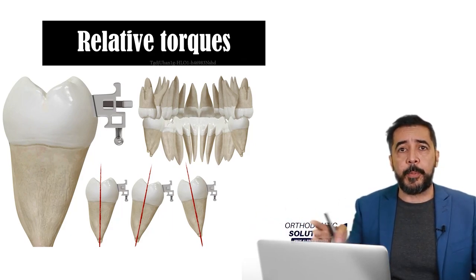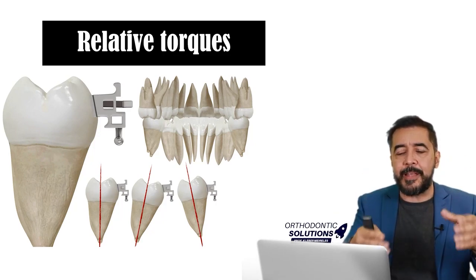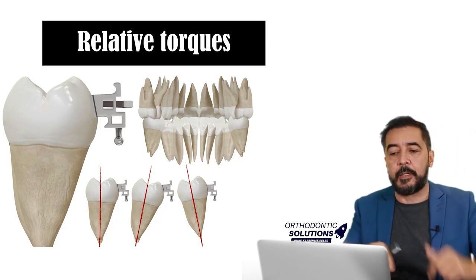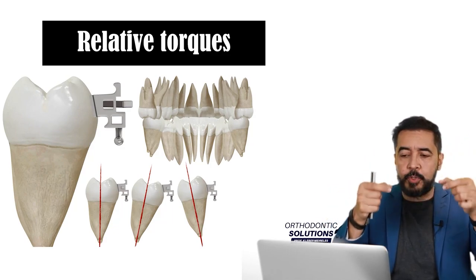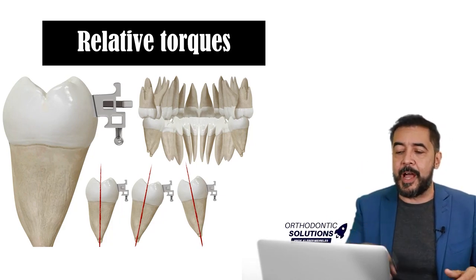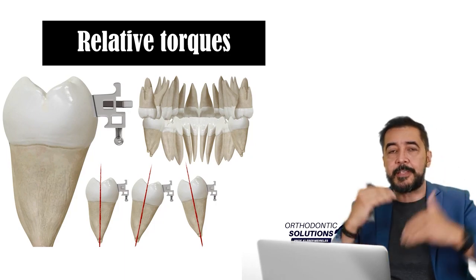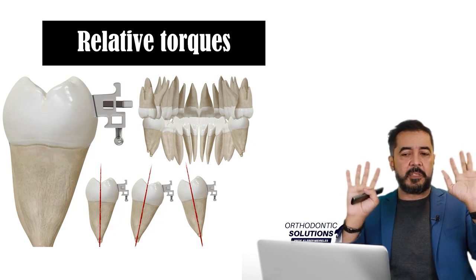If you think about it, it's very common because sometimes you want to escape from the bite when you have a deep bite, trying to escape the contact between the crown of the upper teeth and the tube. Sometimes we do that without thinking. We flee from that position, going down with the position of our tubes. Sometimes we want to do that in order to not need to put, for example, bite ramps. Just go downwards a little bit and we think it's okay.